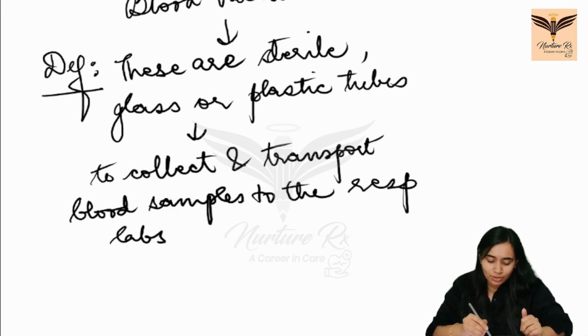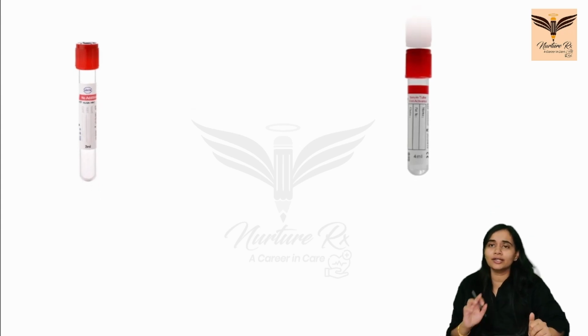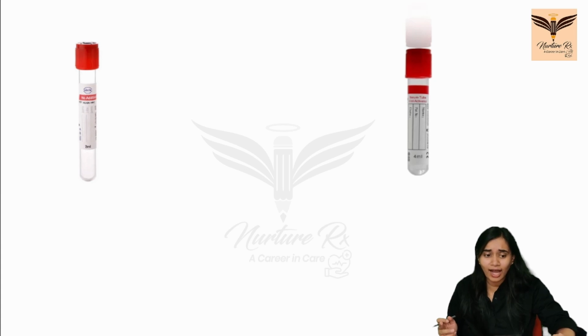Okay. So coming to the first one. This is your red vial. This is red top. I'm telling you, all of these are color coded, so you have to remember the color also, and you have to remember why and how they are used. Okay.